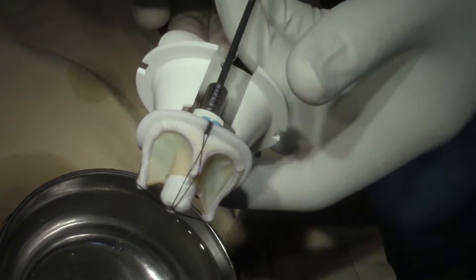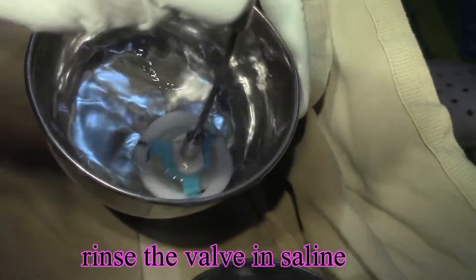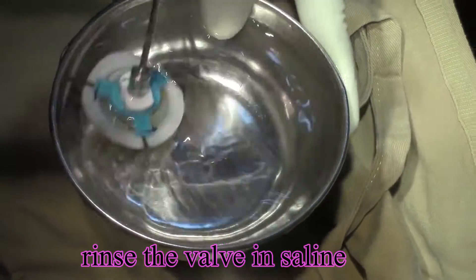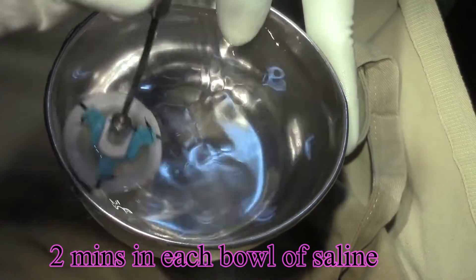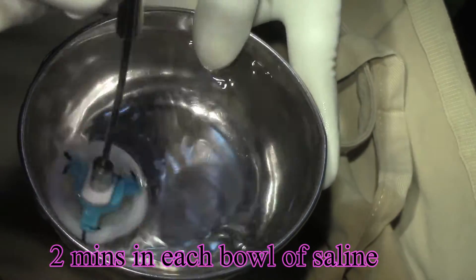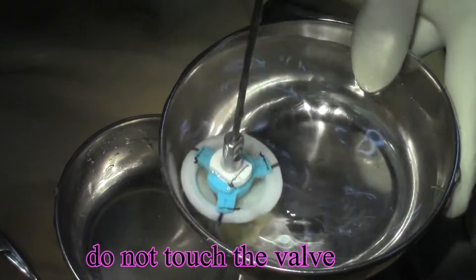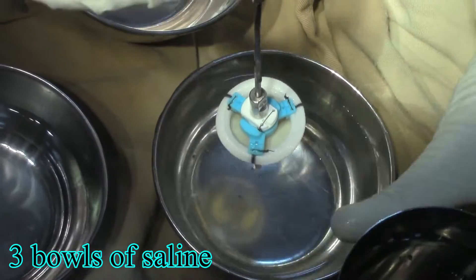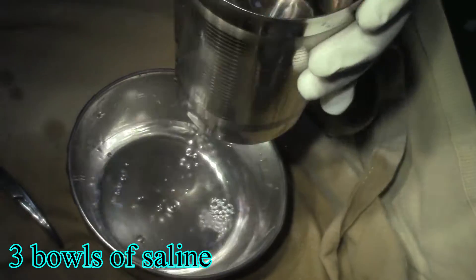Once this valve is removed from its aldehyde storage solution, we have to rinse the valve. Rinsing is done in two-minute slots. Three bowls of saline are taken, each bowl with two minutes of time. The valve has to be agitated gently within each bowl of saline — three bowls, two minutes each, gentle agitation without touching any of the walls of the bowl.